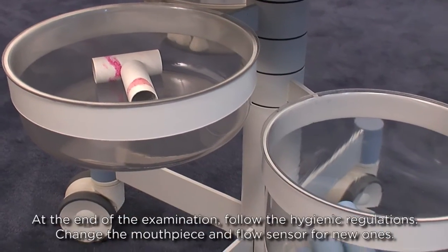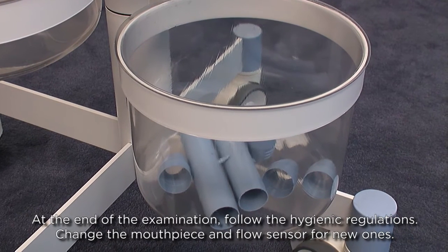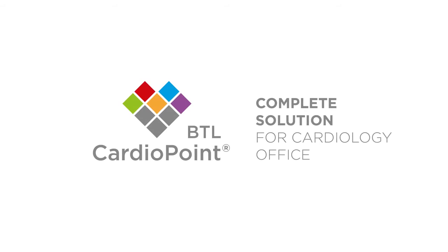At the end of the examination, follow the hygienic regulations. Change the mouthpiece and flow sensor for new ones. Take care.